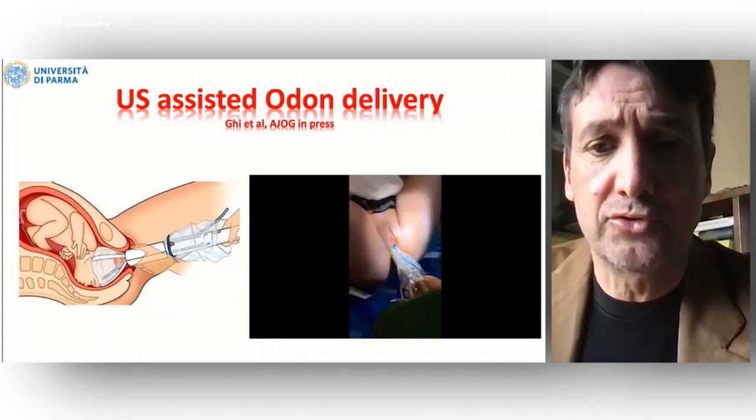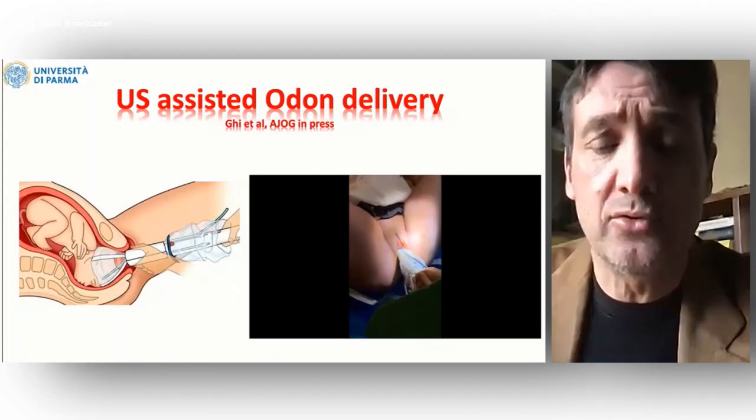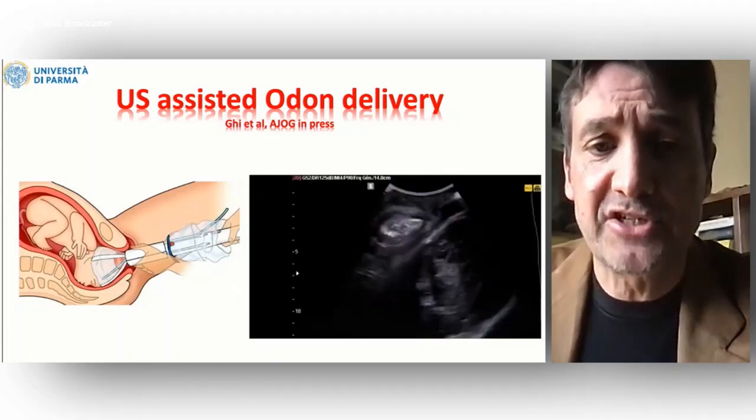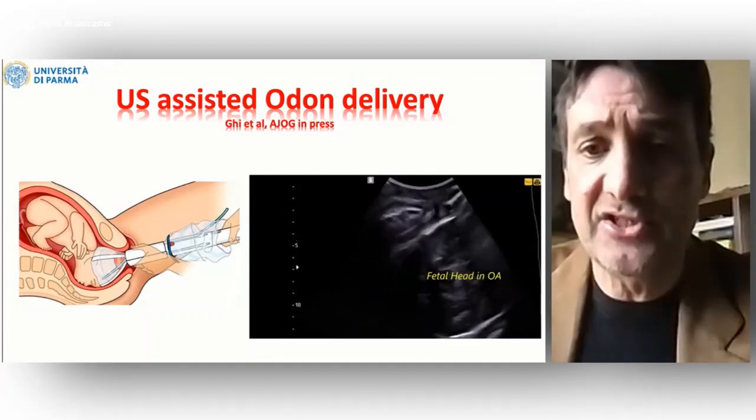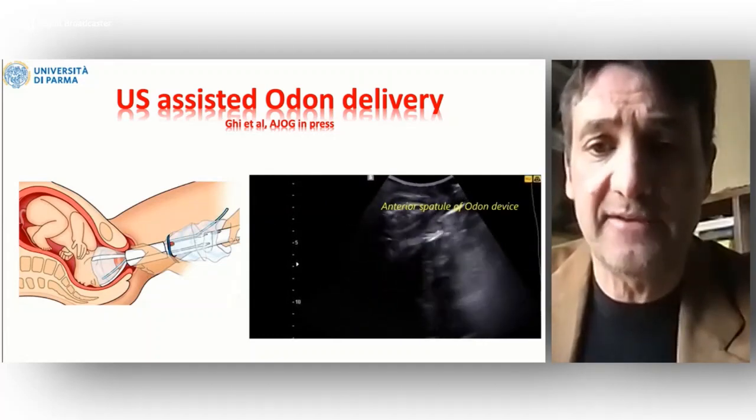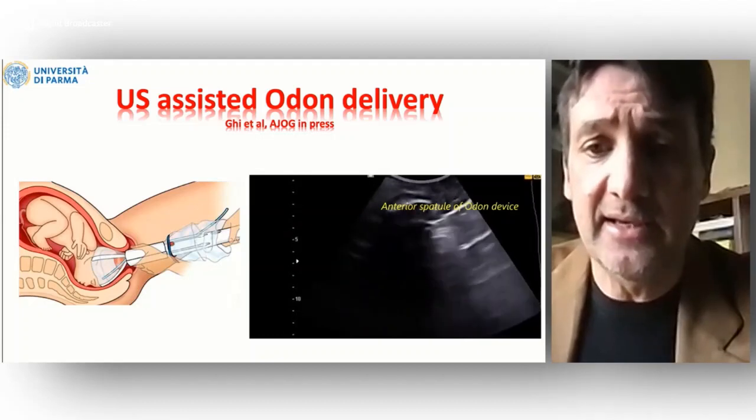I know that most of you are now familiar with this new type of instrumental vaginal delivery that maybe will spread in the next few years. It is about to receive the CE mark.